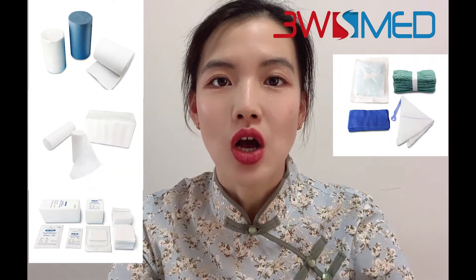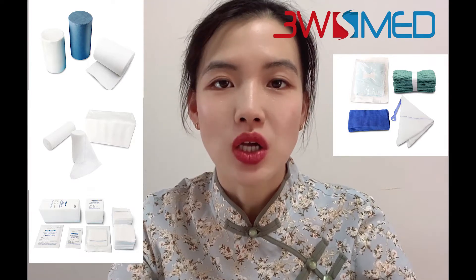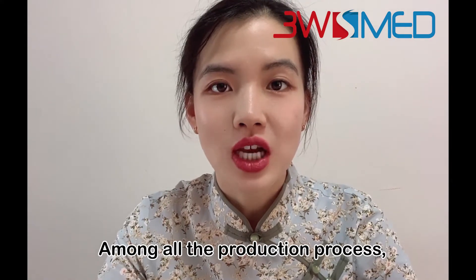Gauze rolls, gauze bandages, gauze webs, gauze abdominal pads — or you can say lap sponges — and gauze balls. Among all the production processes, the previous parts of the bleached gauze fabric production are almost the same.